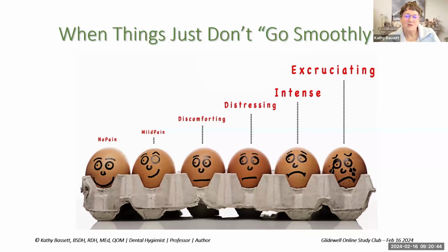So in many situations, the use of articaine alone reduces the number of challenges we encounter. And I think, particularly as we're doing more supplemental articaine infiltration, a lot of people are really registering that as, that just really helps me get through those challenging cases, or intercede when I have incomplete anesthesia. But then what do we do when things just don't go smoothly at all?